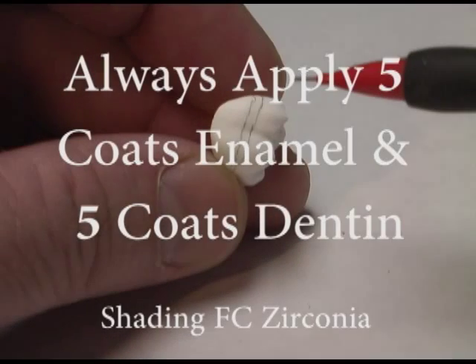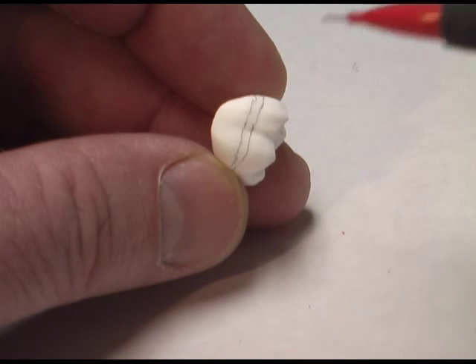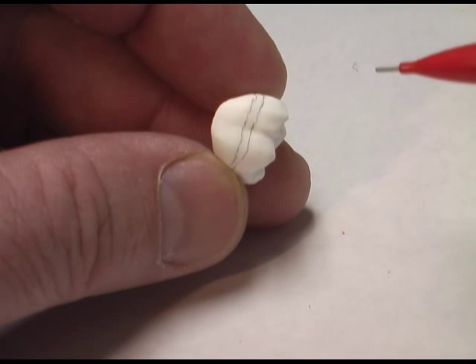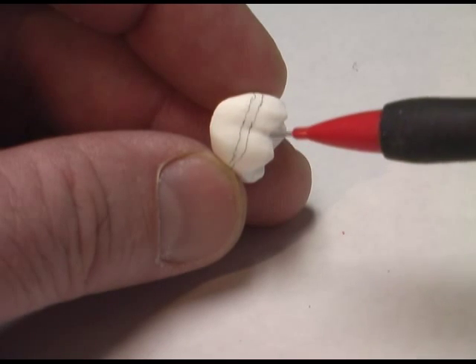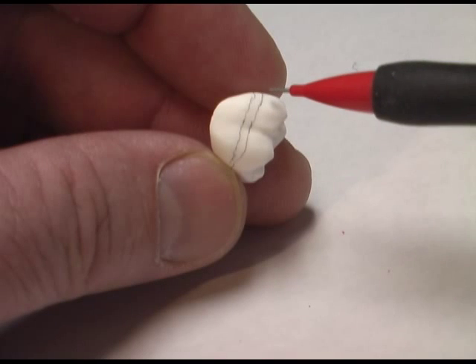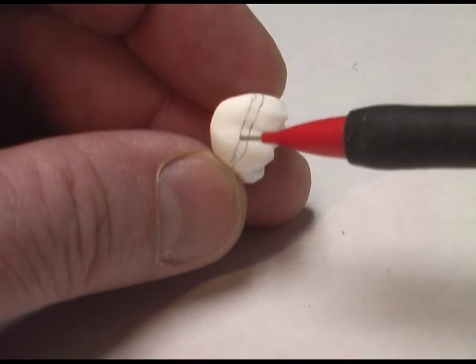We're going to add five coats of incisal liquid and five coats of dentin liquid, covering the entire restoration with at least five coats. We've got our transition line here — we've created two lines: one closest to the occlusal and one closest to the margin.